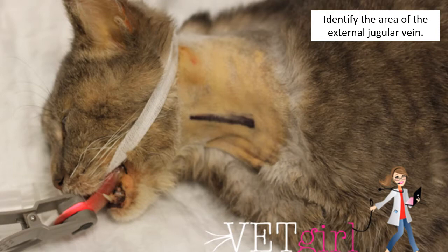Remember when we were discussing how to remove tumors? And you have to mark the healthy margins. You are going to cut on those areas. So you need sterile markers for that. That's what they used in this image.